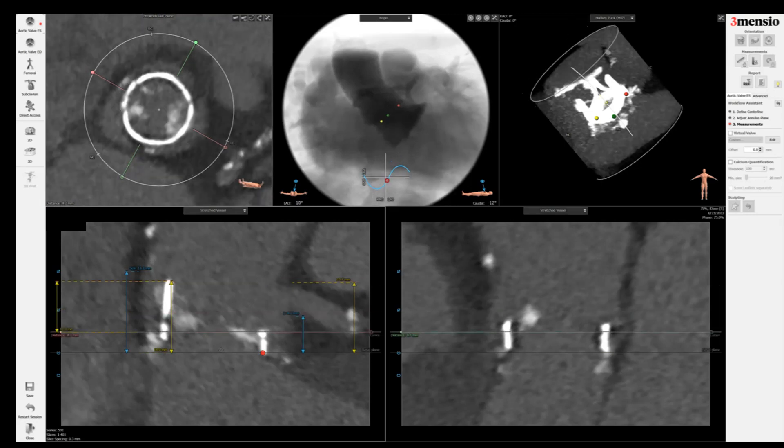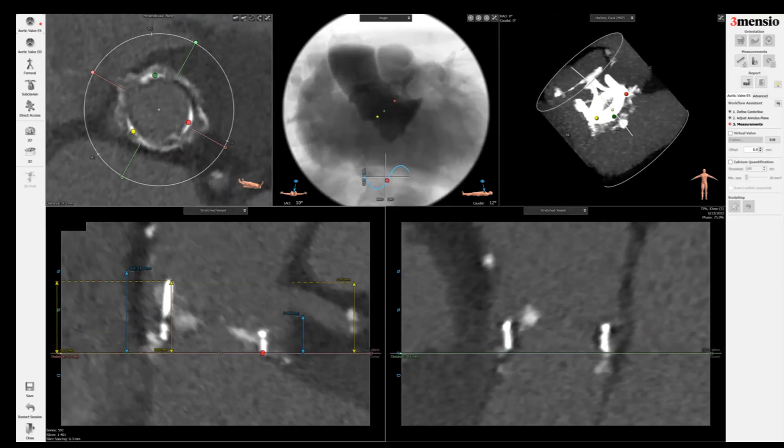I'm going to create a box as if the valve becomes like a tube graft so that we can assess the coronary obstruction risk. I'm going to draw the internal diameter of the surgical valve — in this case it's 22. If you use a balloon-expandable valve, you can actually stretch the leaflet further than 22, maybe even to 23 or 24. So you might need to draw a bigger, wider box to account for the coronary obstruction risk.